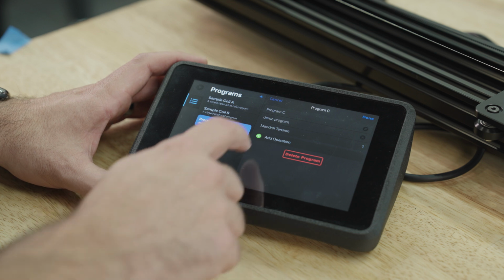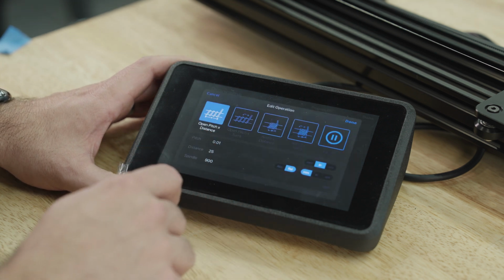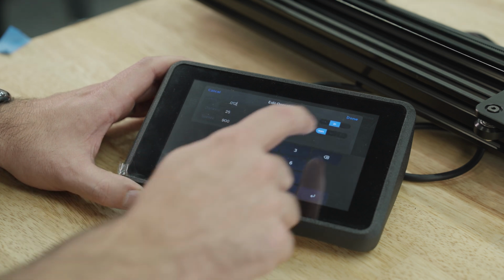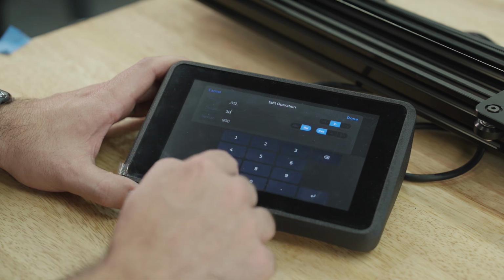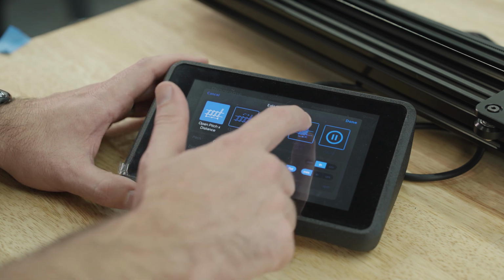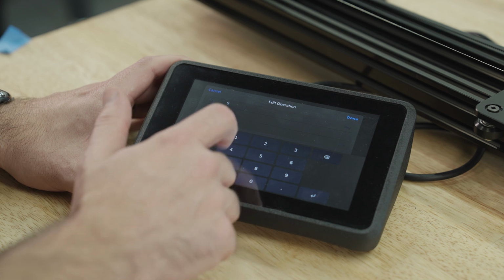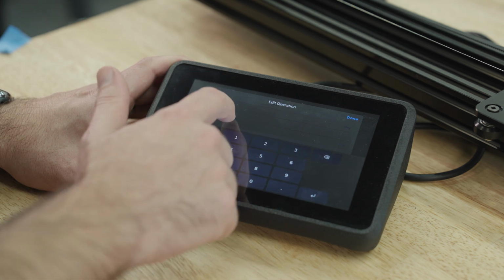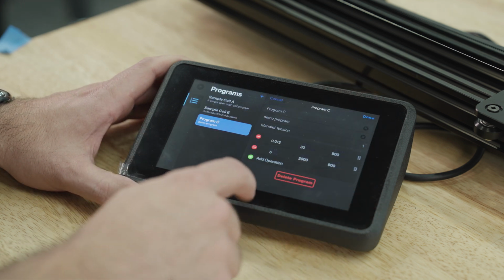Now let's add some operations. Press the plus icon to add an operation. We'll do an open pitch move with a pitch of 12 thousandths in inches and a distance of 30 millimeters. Let's add another operation. Now we'll do a move where the angle is controlled, and I'll select 5 degrees. For the number of turns, let's pick 2,000. We'll leave the spindle speed at 900 and press Done. Our program is ready to go.